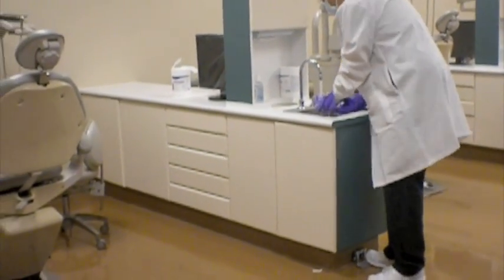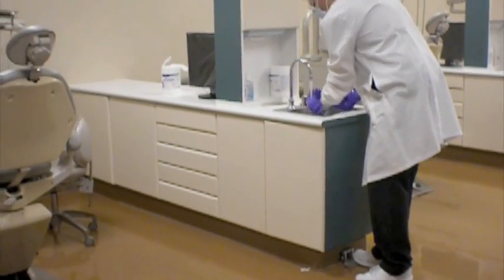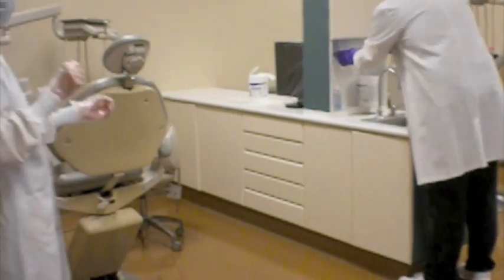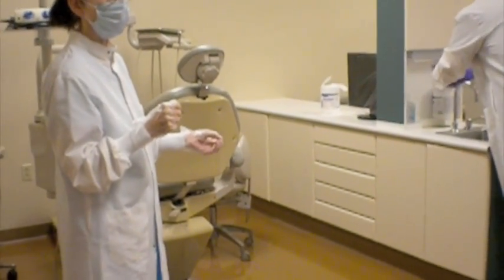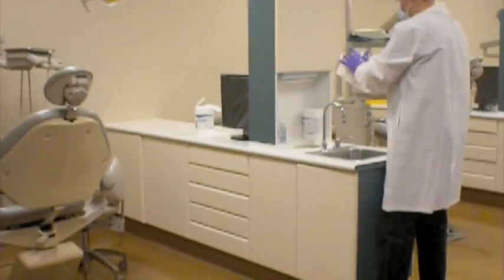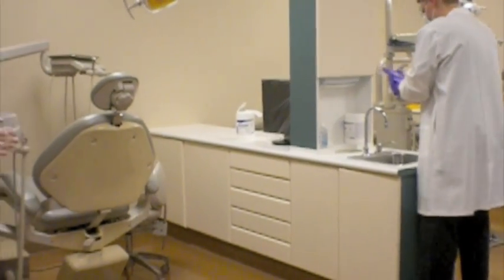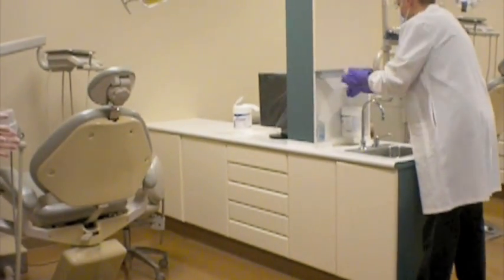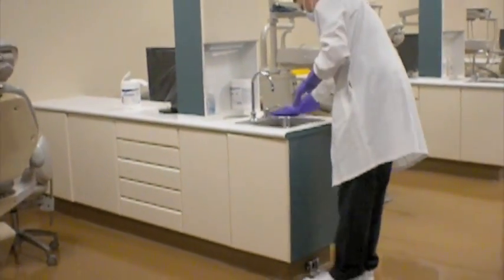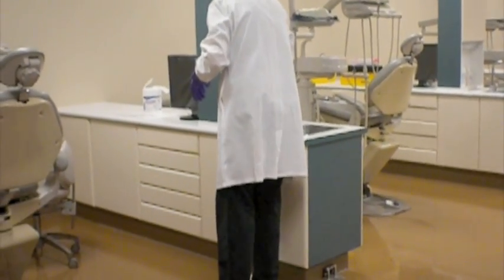Something has to happen in order for us to get to the next step of bringing the patient treatment supplies into the unit. Okay, we're not going to just get out of these gloves and go get our kit and our instruments and bring it to the unit. We have to prepare the area to receive those things, to also sanitize and disinfect our patient treatment supplies. So let's say he's at the end of disinfection of the unit. He's now going to take an additional paper towel and go over to the counter and put that paper towel on the counter.